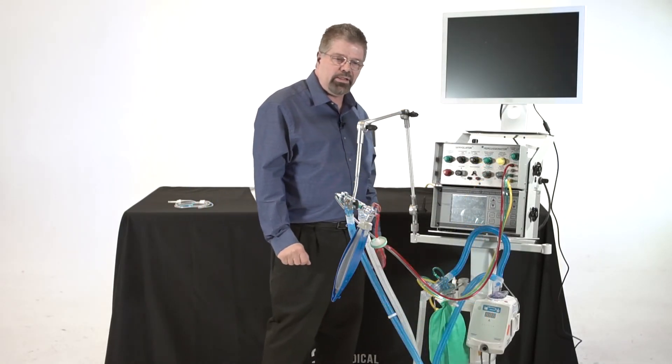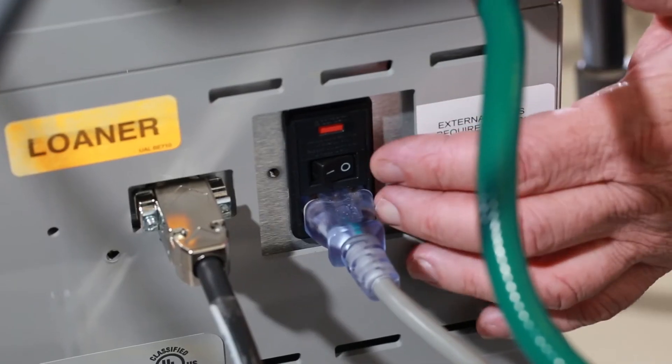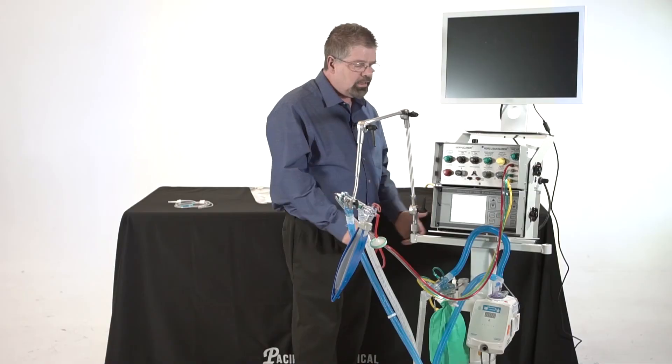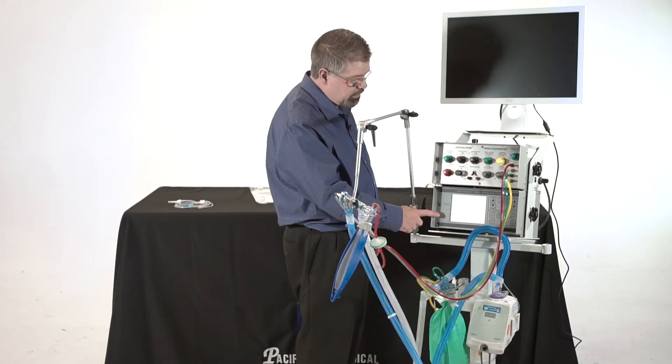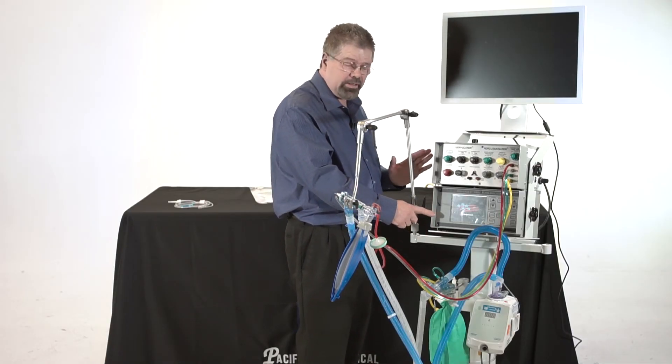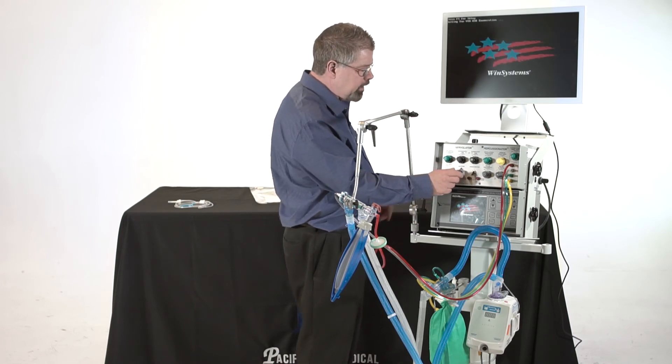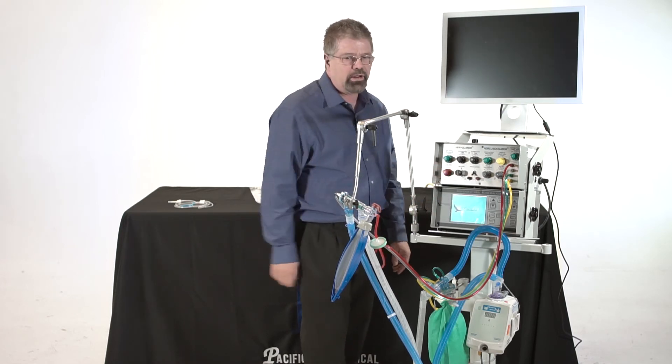So we want to now turn the ventilator on. I'm going to come back here to this toggle switch. The toggle switch just turns on the monitor. This is a fluidics ventilator. So to actually turn the ventilator on, I'm going to turn on internal working pressure there.